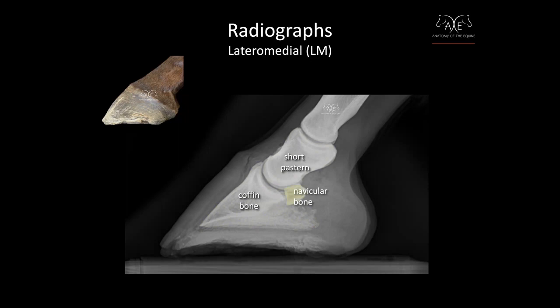This view is really useful for checking your bony alignment — you want to see that the center of these bones line up. You can also look at your extensor process and the top of your hoof capsule to check for distal descent and problems there.